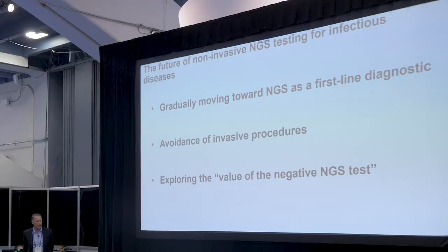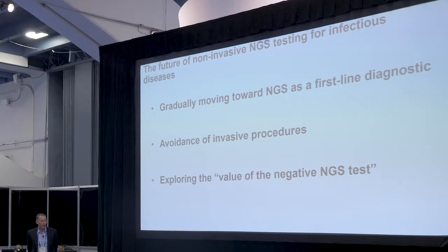So where do I see some of the future of this non-invasive NGS testing? In our institution, we're moving this more and more to first line, not waiting a week, 2 weeks, 3 weeks, trying to chase fevers of unknown origin. We're utilizing this more upfront, and it's not uncommon in our lung transplant populations, where as soon as they hit the door, my lung transplant doc is getting this test ordered. So we found it very, very useful even for some first line applications.